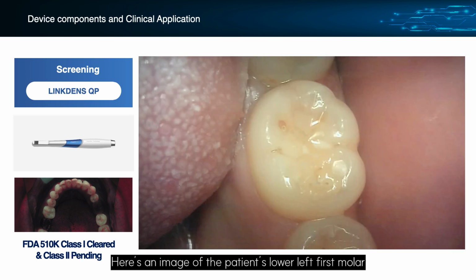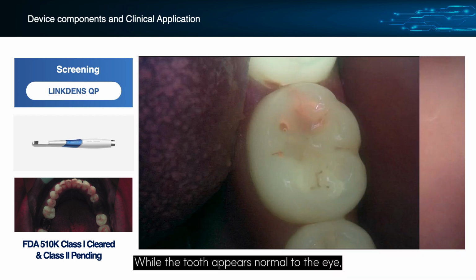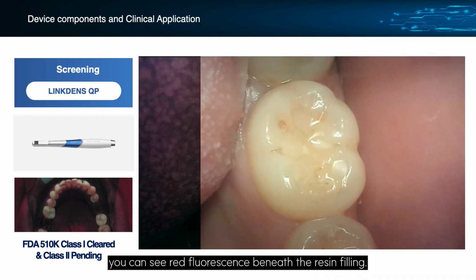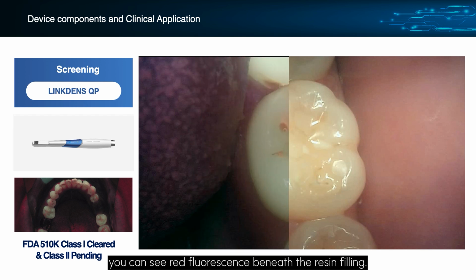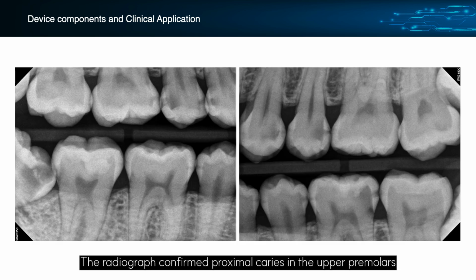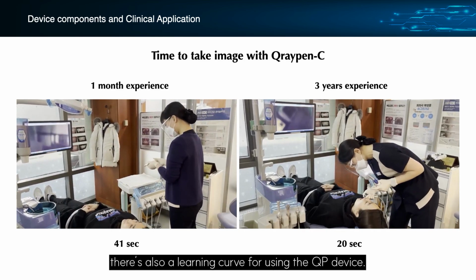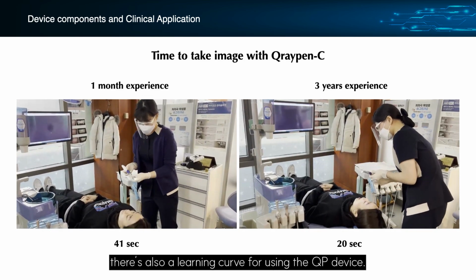Here's an image of the patient's lower left first molar, tooth number 19. While the tooth appears normal to the eye, you can see red fluorescence beneath the resin filling. So with the patient's consent, we took a bite wing radiograph. The radiograph confirmed proximal caries in the upper premolars and progressed caries in the lower left first molar, tooth number 19. Just like with other equipment, there's also a learning curve for using the QP device.